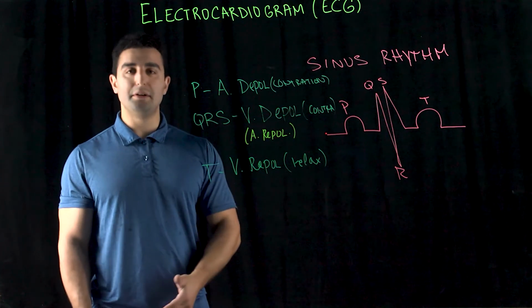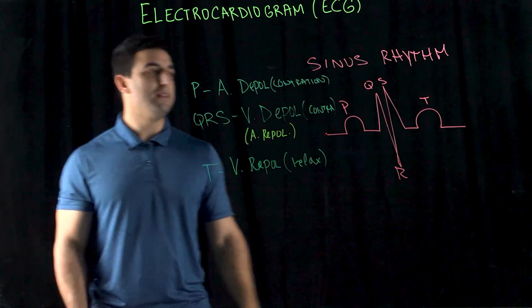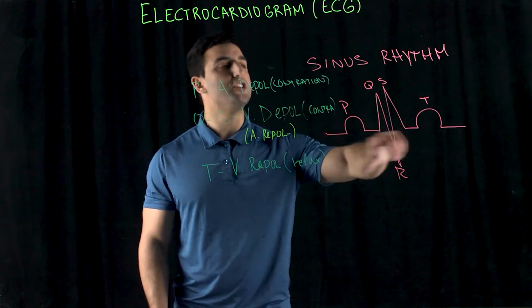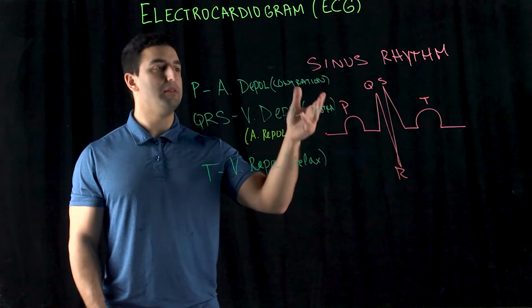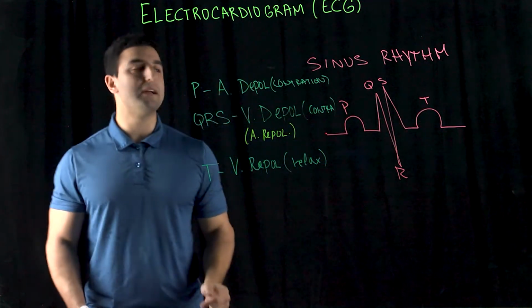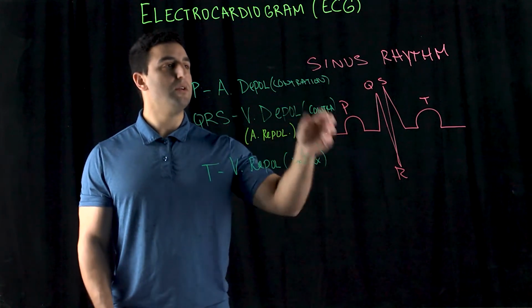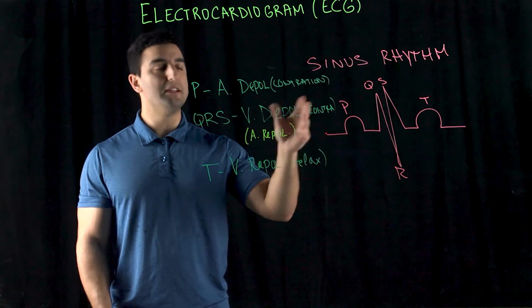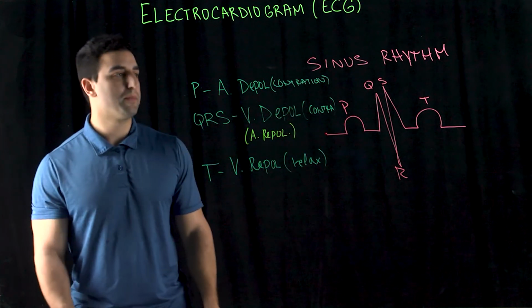But because the money was coming in and the insurance covers everything, they put you on an ECG, and they monitored the conduction of each sinus rhythm that's taking place. And any kind of changes in this would indicate some kind of myocardial infarction, right? And so this technology is a great way of detecting abnormalities of the heart.